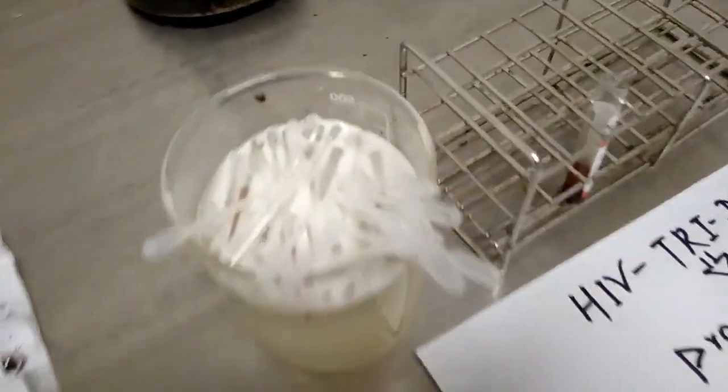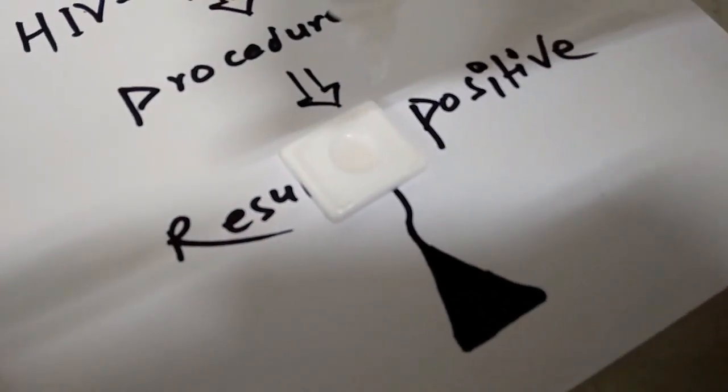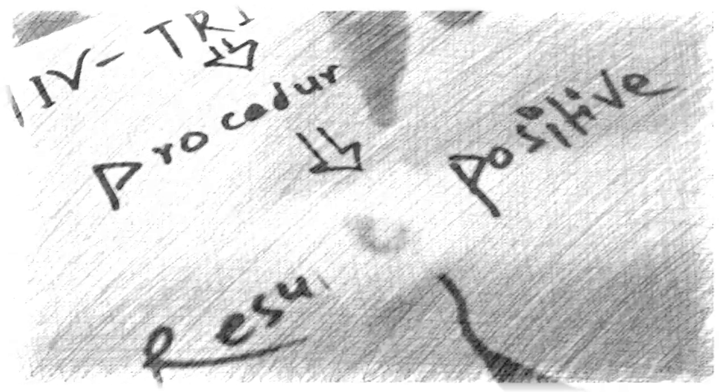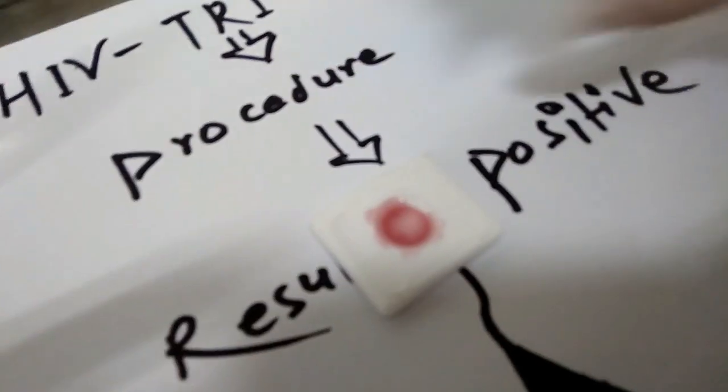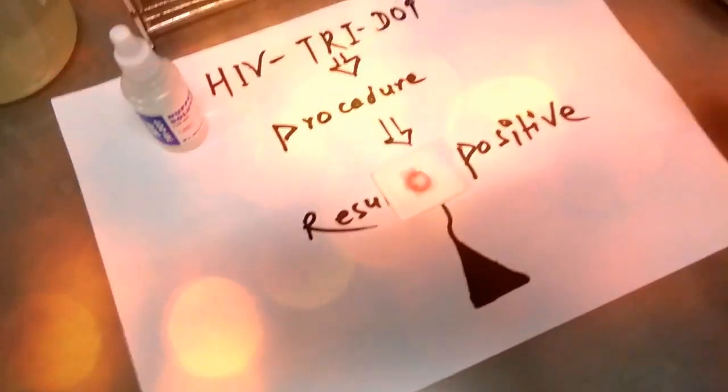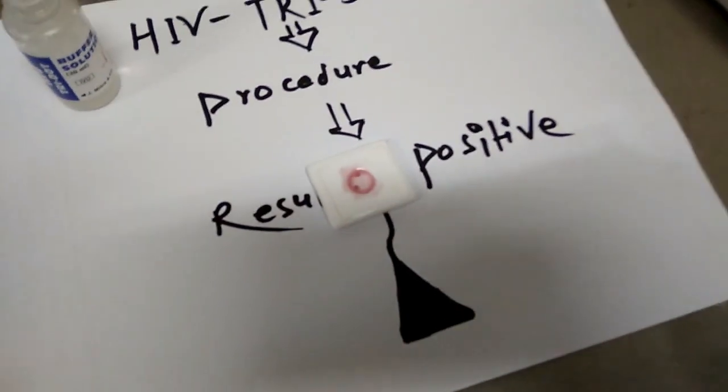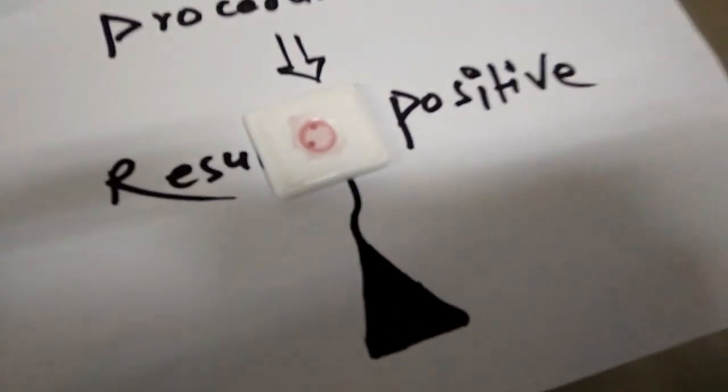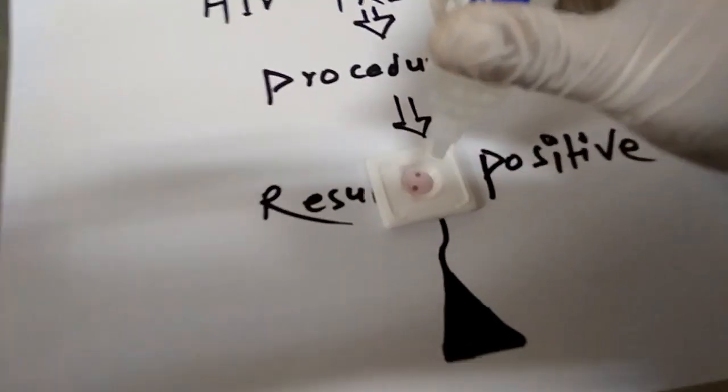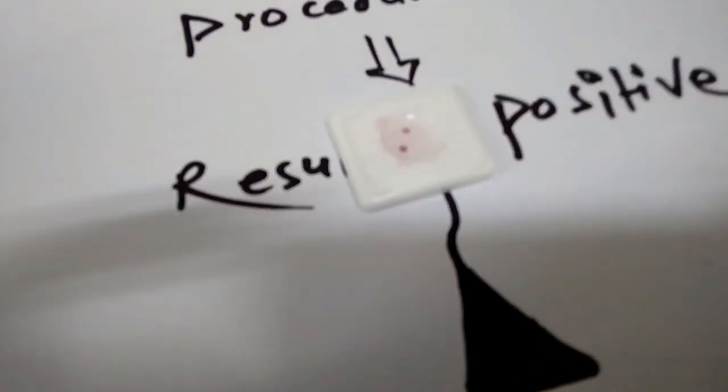After that, add five drops of buffer and wait for drying. Add two drops of conjugate and leave for drying. Finally, put five drops of buffer solution and proceed to take the reading.